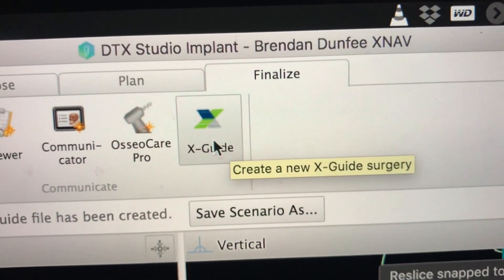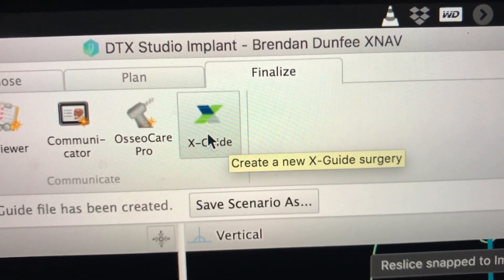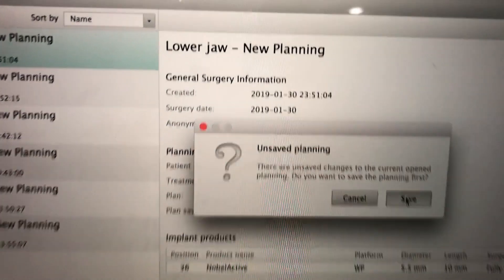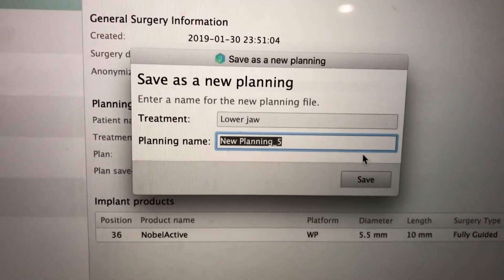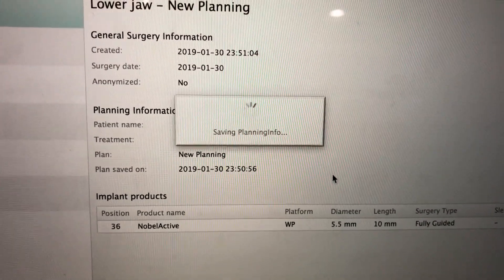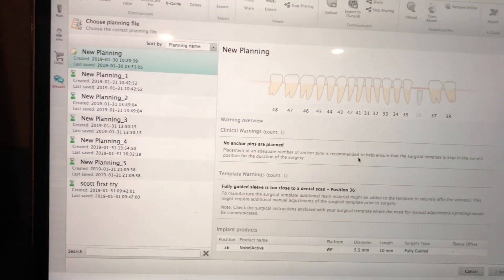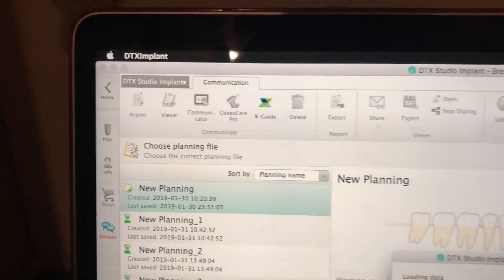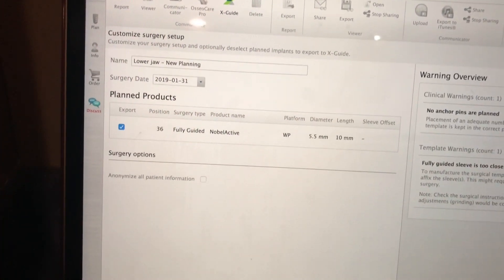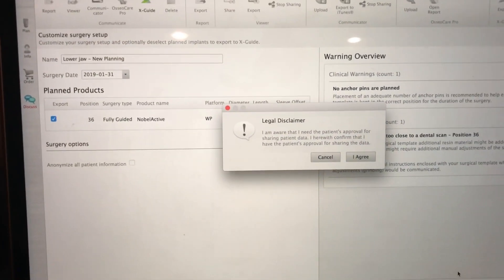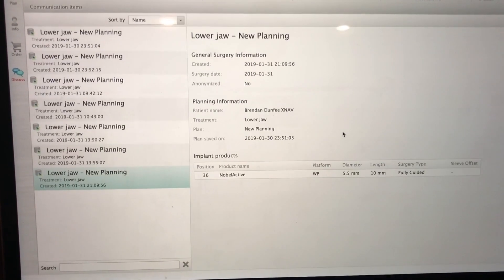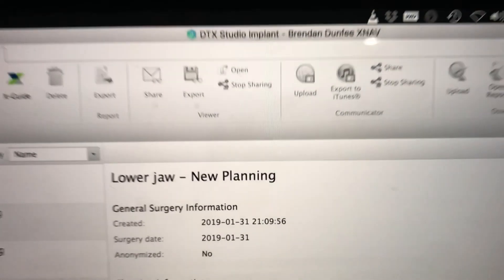We can look for the X-Guide button at the top of the screen. We're going to click this button and this will start the process. We're going to save that file, and then we're going to take that file, which is going to be transferred over the internet, on jump drives, or somehow. That X-Guide button is at the top of your computer. Once the file is transferring, we have to click finish — it's quite simple. There will be a legal disclaimer that pops up that makes you answer to it and makes you responsible for the case.